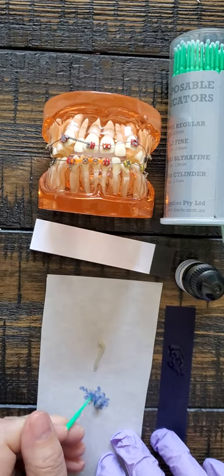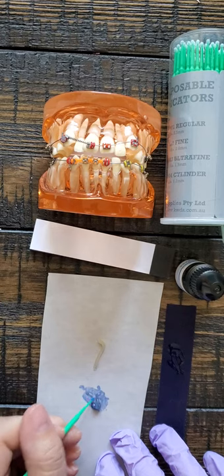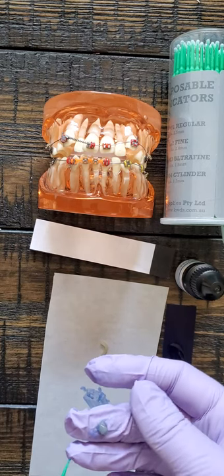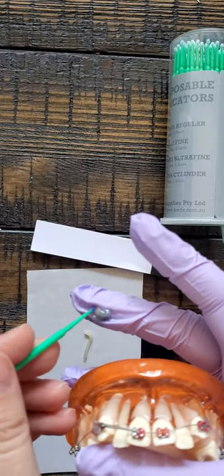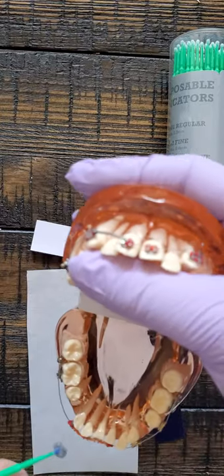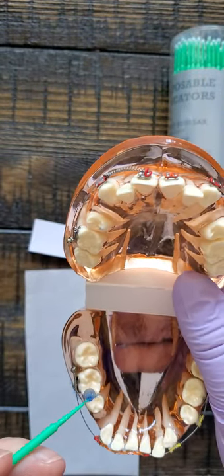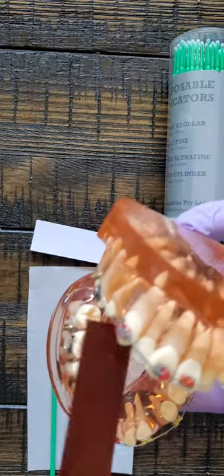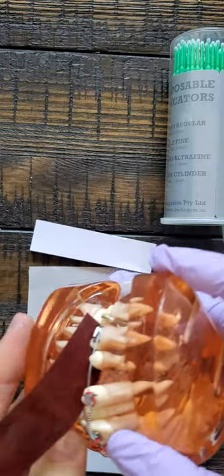Just a really subtle blue — mix it all around. Now, I don't etch and prime the molar when I do this because I don't really care if it falls off. In fact, I want it to fall off — it makes my life a heck of a lot easier. So I go ahead and roll it around. You can even just dot it on there. Then I go ahead and put it with the microbrush on the tooth. It doesn't matter if you do top, bottom — whatever tooth is easier. If it's a mixed dentition case, I'd prefer to do it on a baby tooth rather than a permanent tooth. Usually I'll do it on premolars or molars. Make sure it does not go in between the contacts. You also want to put it where they're biting, so it's a good idea to have the patient tap and grind around to find the spot, including all excursive movements.